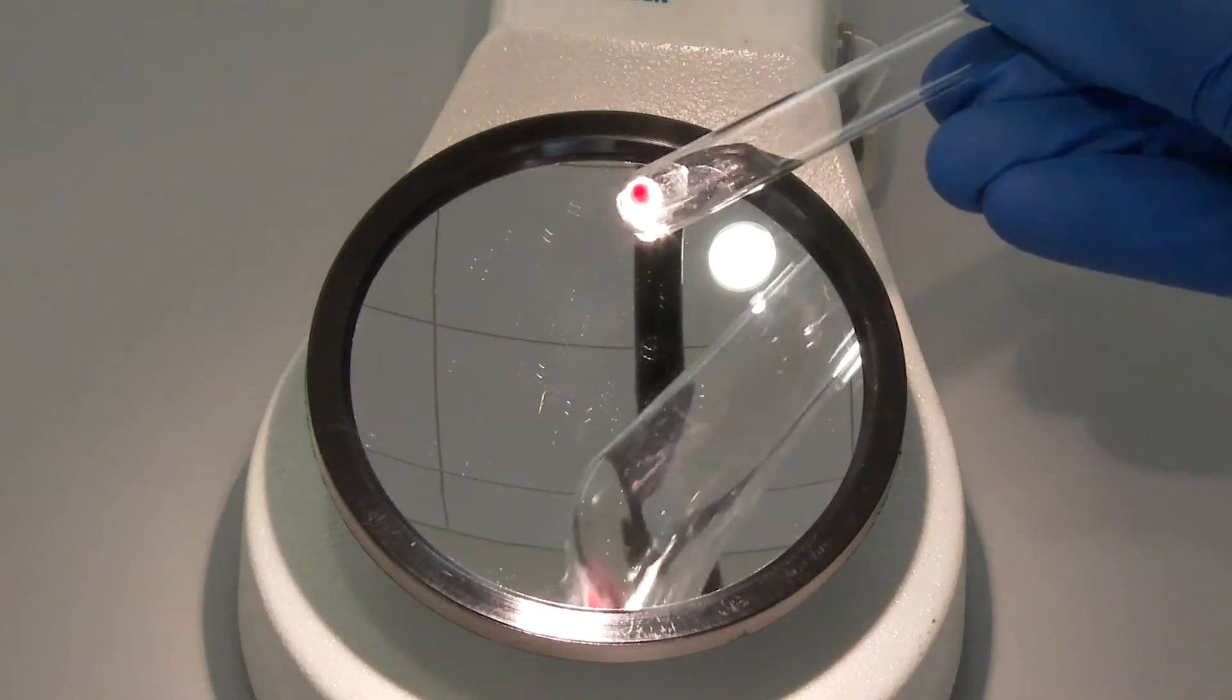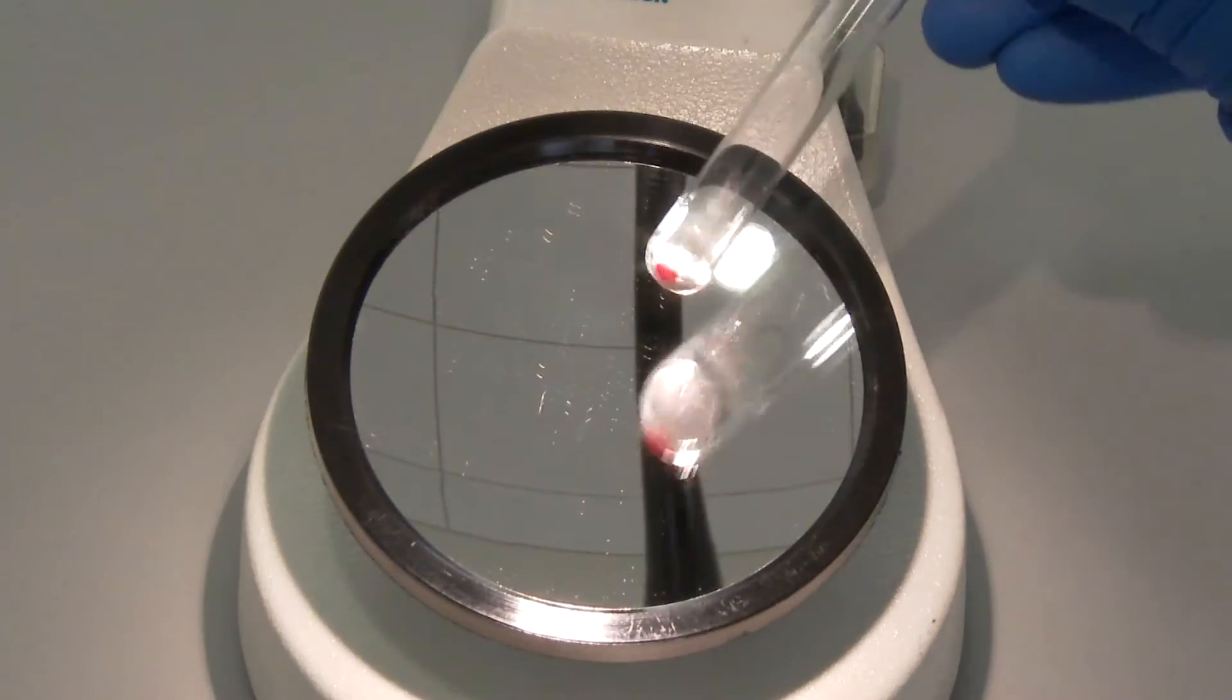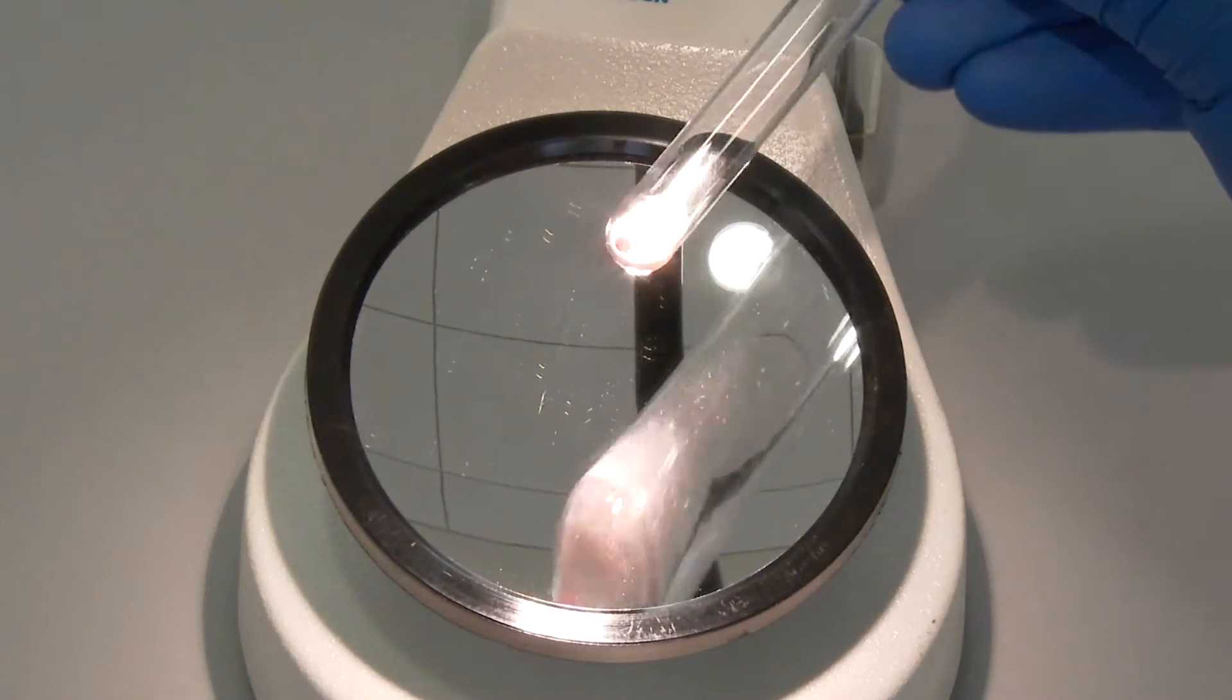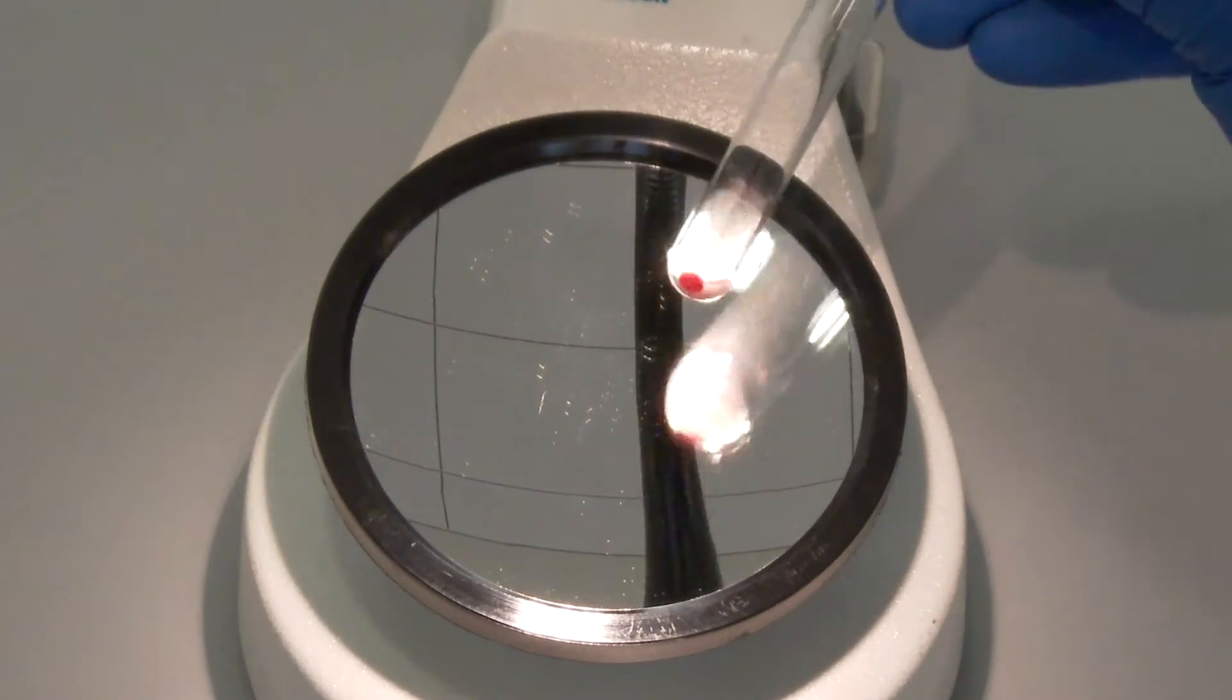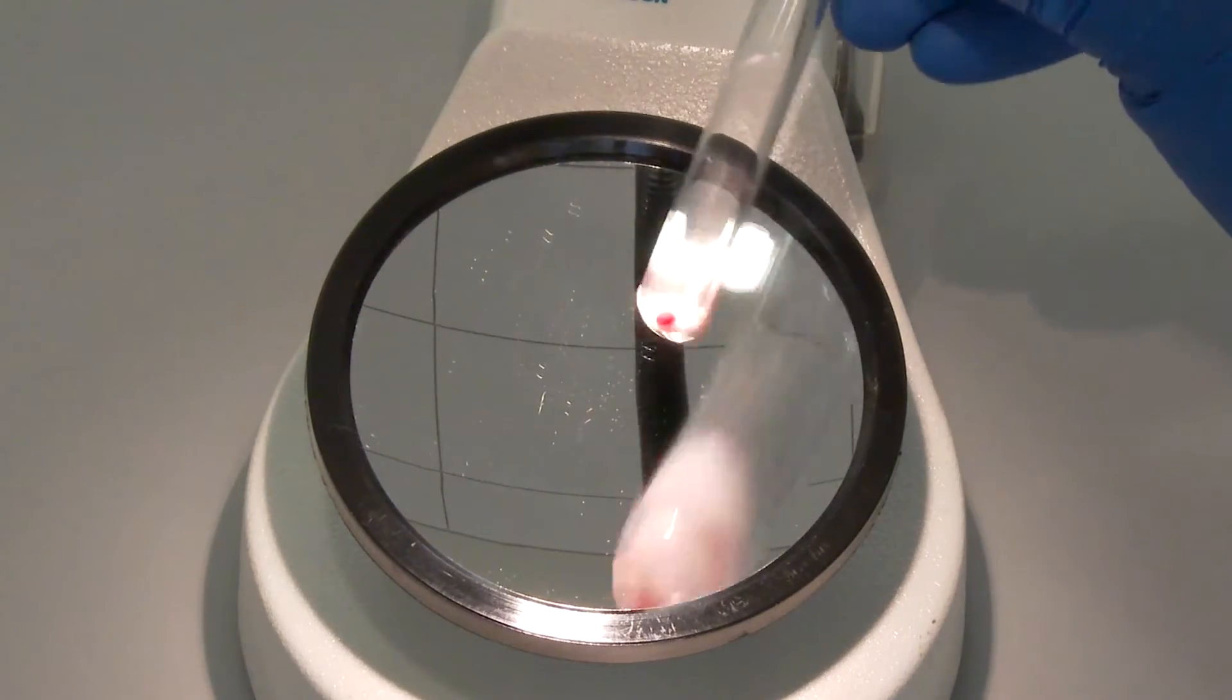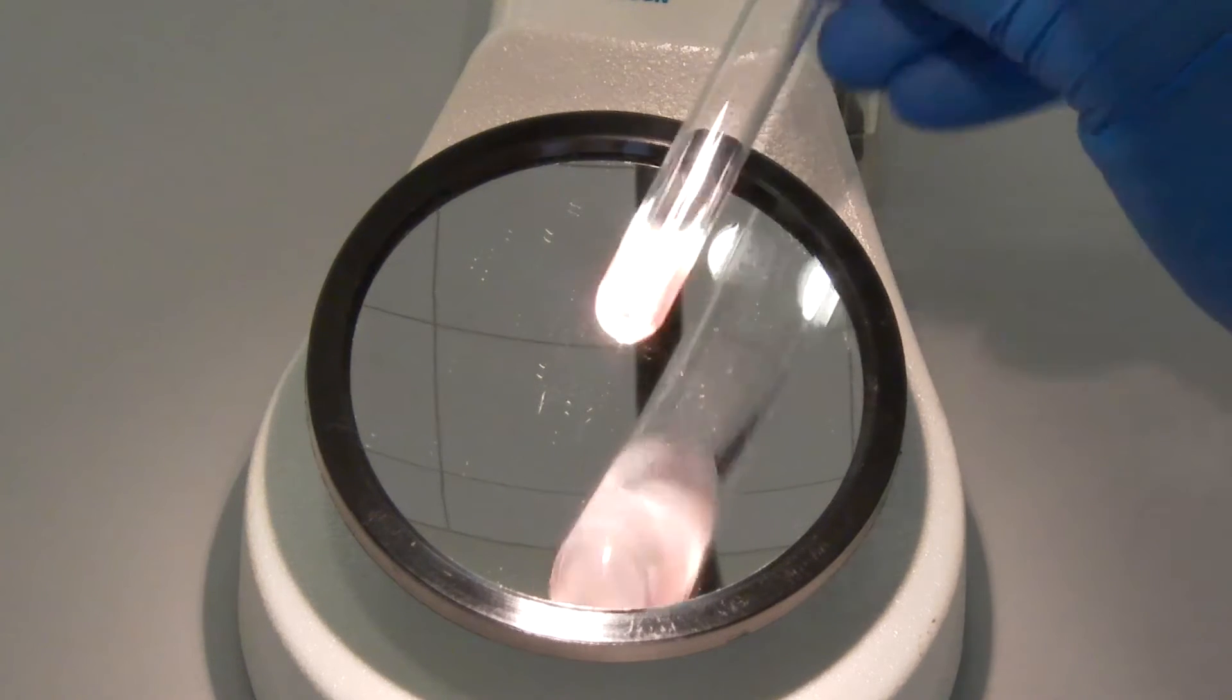As an important note, sometimes a very strong agglutination reaction can become stuck to the interior walls of the test tube. Care should be taken not to over-shake the test tube in this case, which could break up a 4 plus reaction into many smaller clumps and could result in making a falsely weaker interpretation of the original reaction.